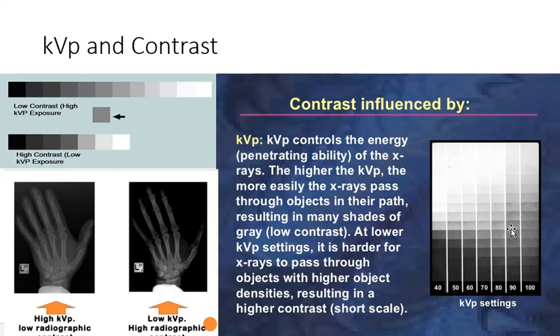If you use a high kVp on something, pick your anatomy, pick whatever absorber you're shooting, a very high kVp will penetrate where low kVp won't. So let's say you're trying to penetrate this step on the step wedge right there. If you reduce below 40 kVp, you're probably not going to penetrate anything through that particular step. Whereas if you decrease from 100 kVp by 10%, you're still going to penetrate through it.